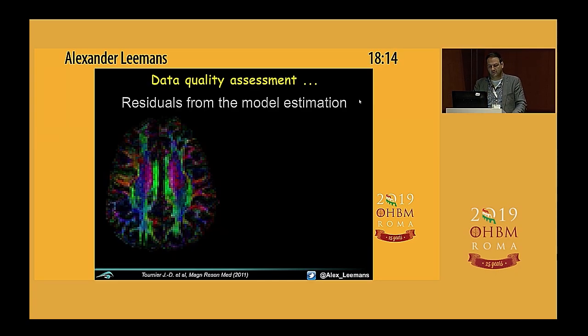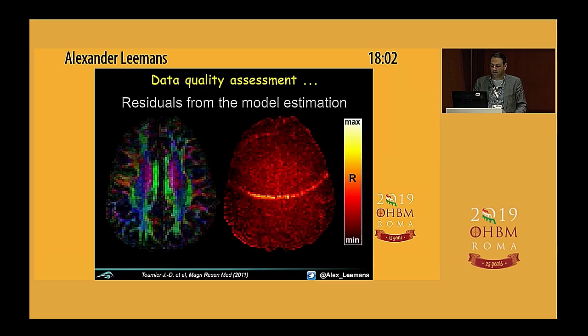Here's another one. And again, if you look at the data now, you can't even see the artifact, right? It's like the Gibbs ringing one. If you know it, you can go back and look at the FA map and stuff. But here, you can hardly see it. Looking at the residual map, you can clearly see that there was this kind of ghost artifact, right? This fold over. So this is the fat in the neck, and if you don't apply enough fat suppression, you'll get this kind of rim in the data. And actually, looking back, you may argue, well, I do see a bit of dark band over here, but that's self-fulfilling prophecy, right? You couldn't spot that beforehand, really.